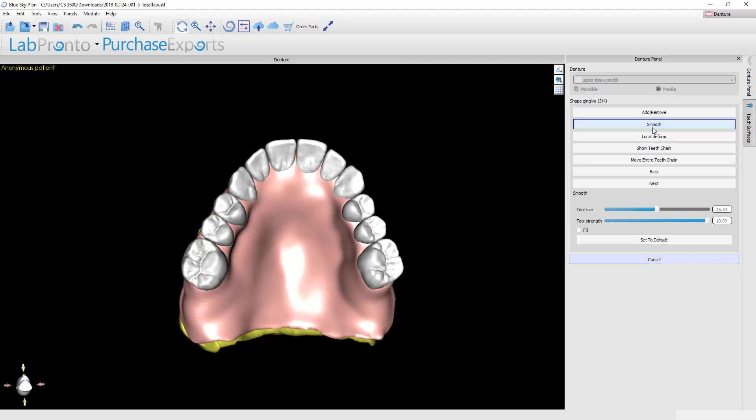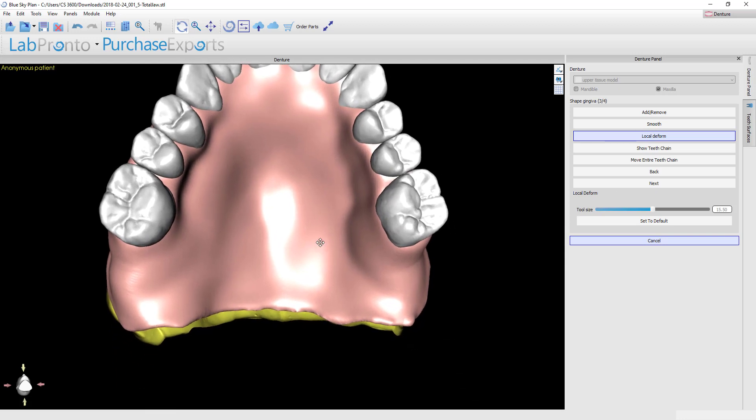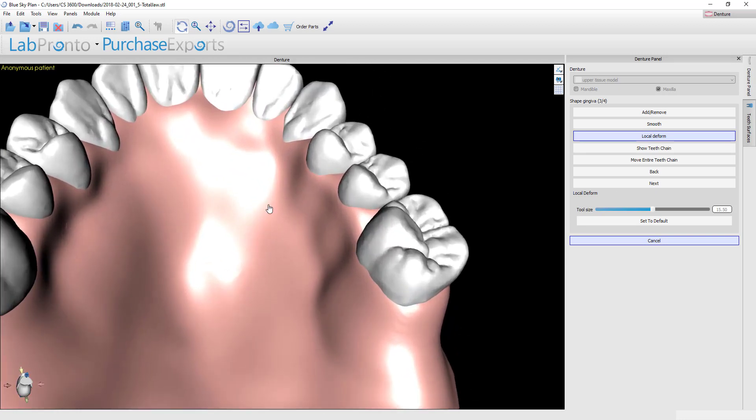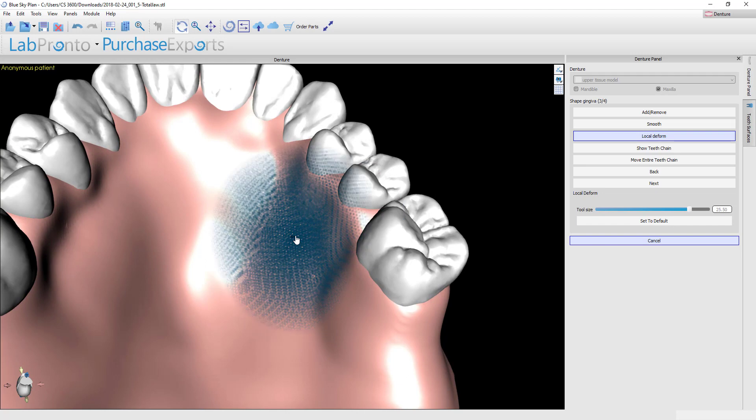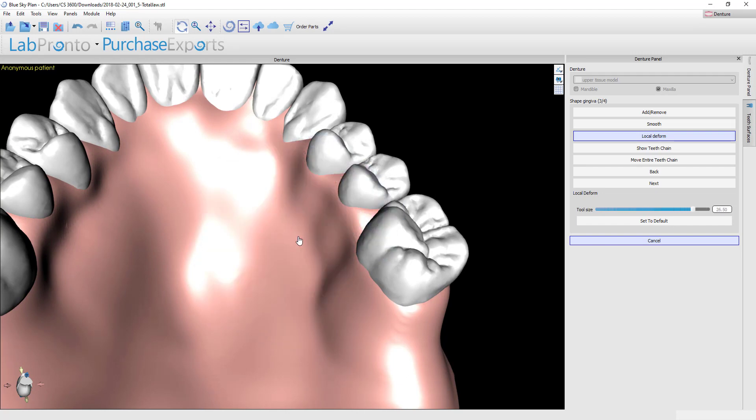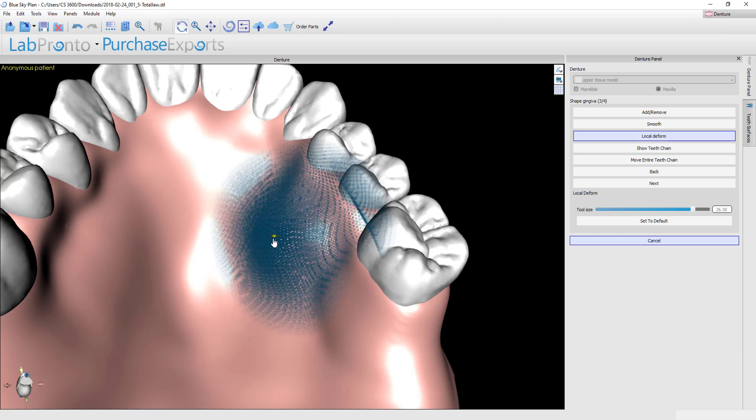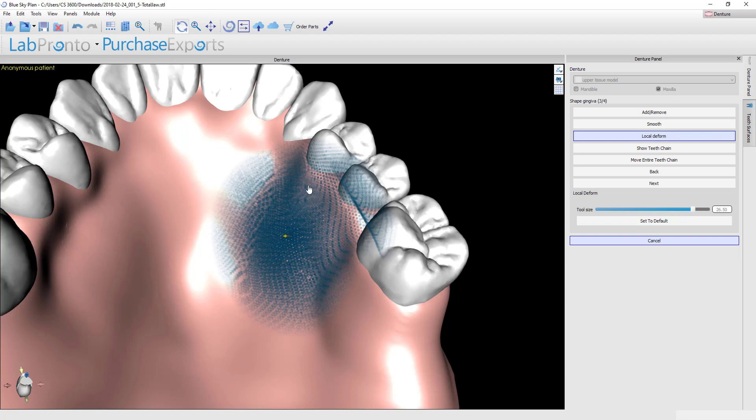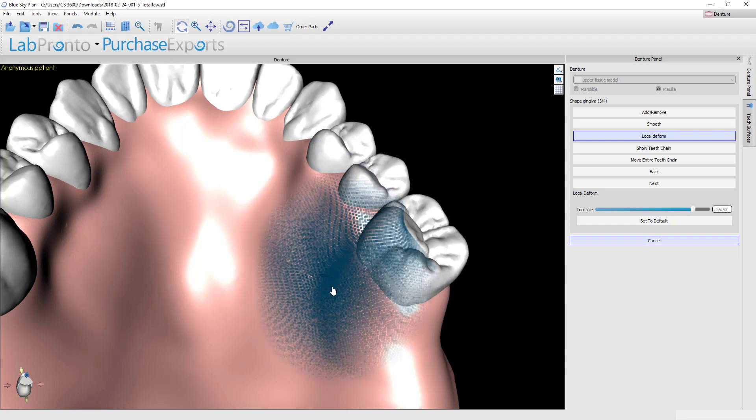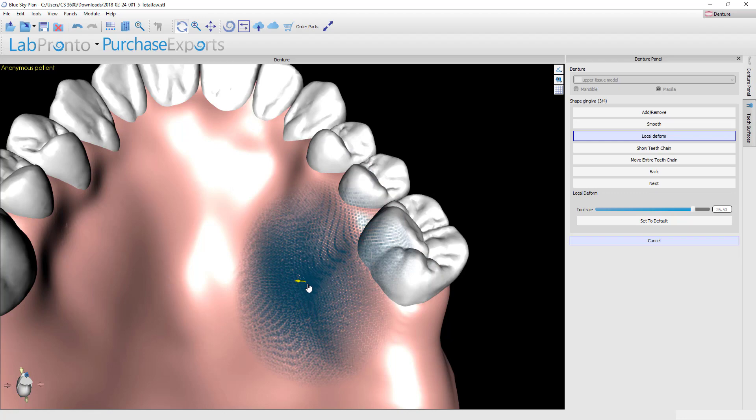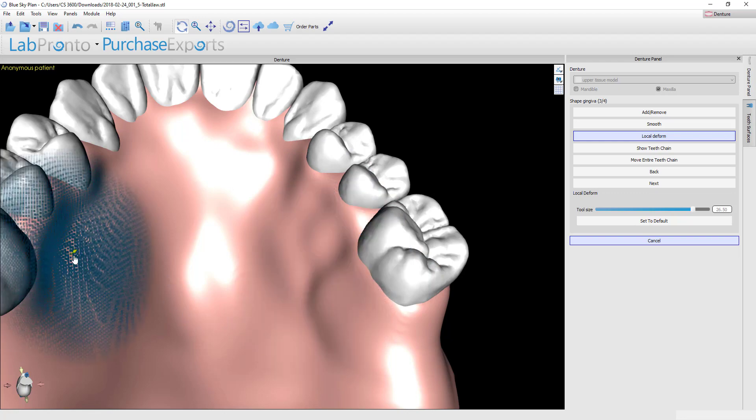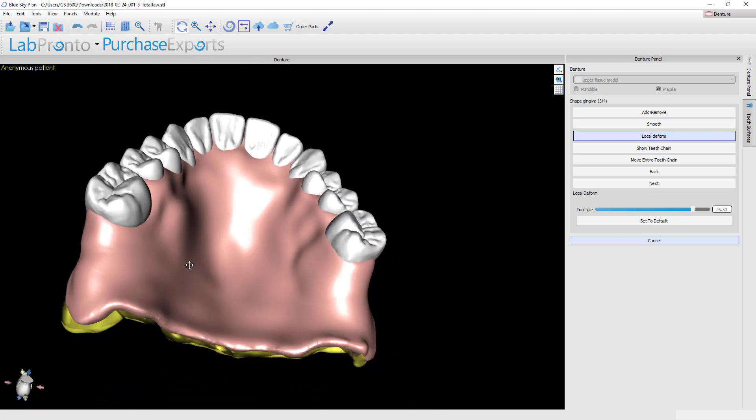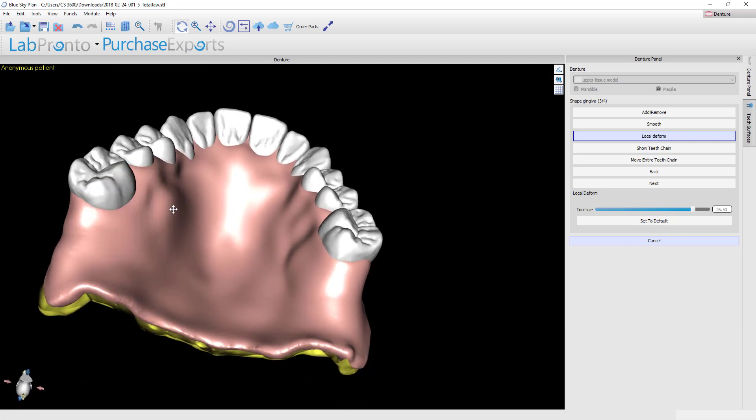Next we have the local deform tool. This is a great tool if you're trying to make pretty significant changes in a very quick manner. Using the shift key and your scroll ball, you can change the spot size, and then holding the shift key, left click, and you can see what it does is it will grab all of the mesh that's residing underneath this spot size and you can pull it in or out and make very big changes quickly. Right here where the gingiva is kind of caved in a bit, I'm going to stretch that out.